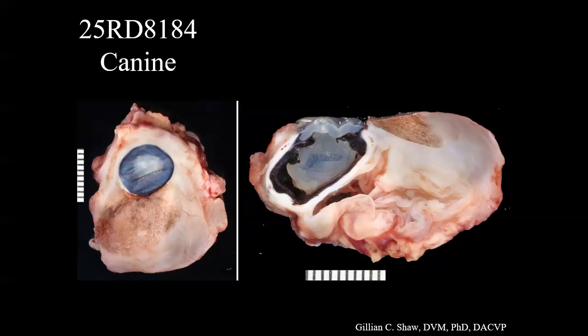Congenital orbital cyst with microphthalmia. So really they didn't even need to submit this case because they already got the diagnosis. I'll just tell you right now, the main diagnosis is microphthalmos with cyst.